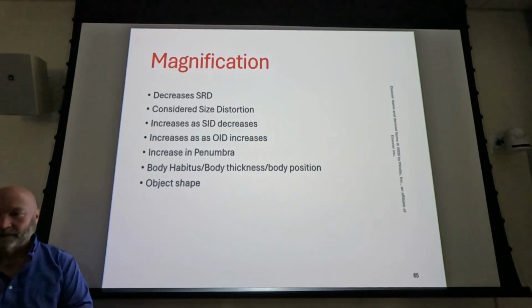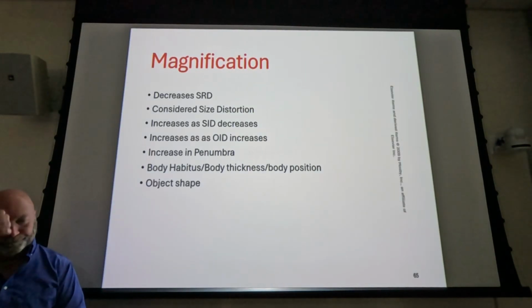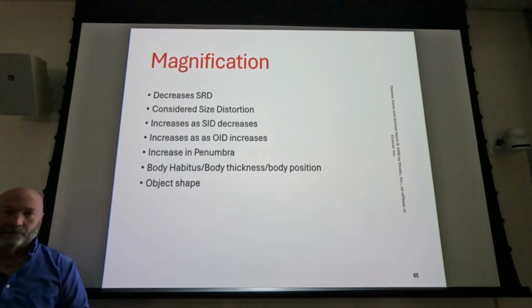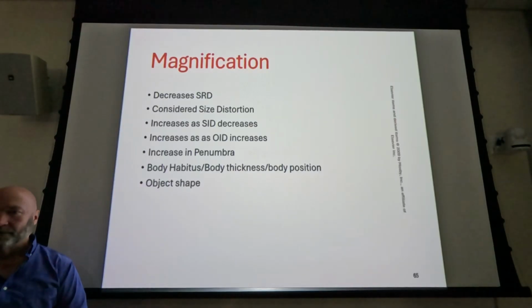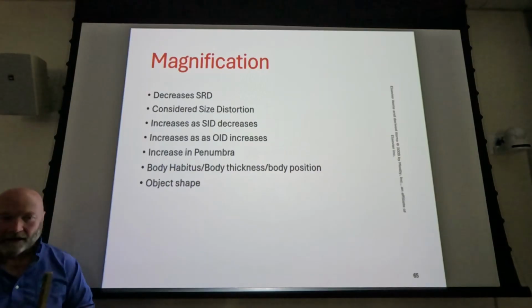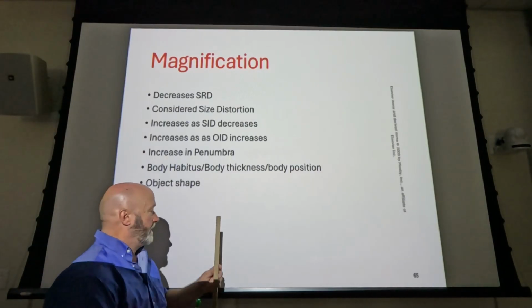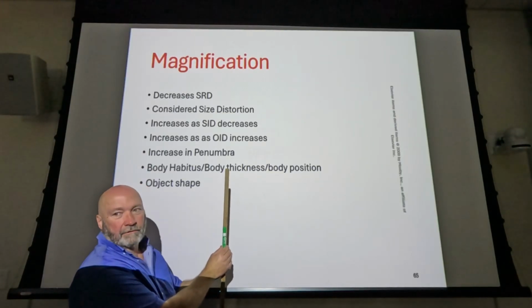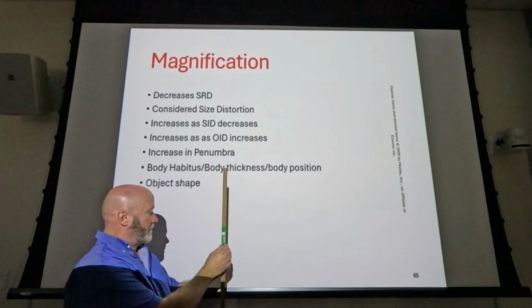And I'll give you a practical example of how that played out one time. Again, it was IVP. And since we just came through contrast studies, this is kind of applicable if you ever find yourself in a situation where you're having to do IVPs. Take a look at everything. Don't just be a button pusher. Take a look at everything. So you do your scout image, and what you're going to see on the scout image is the spine.